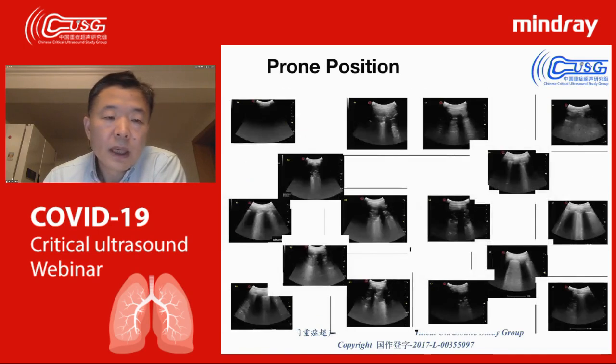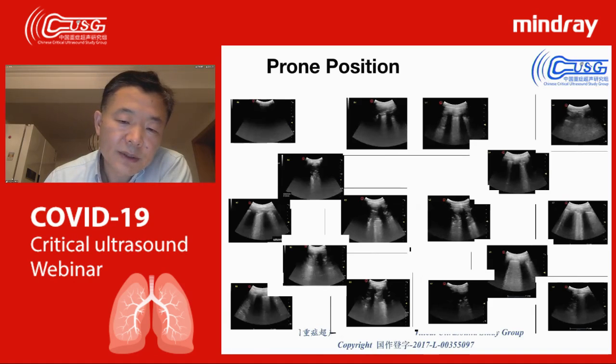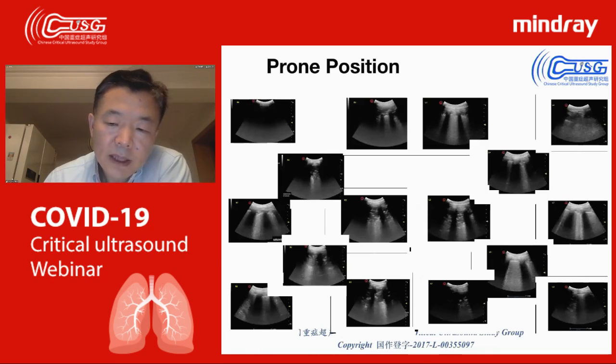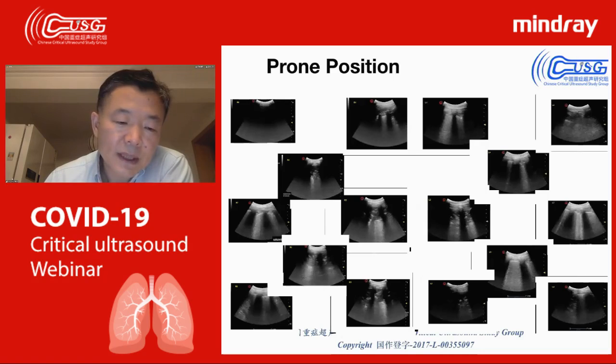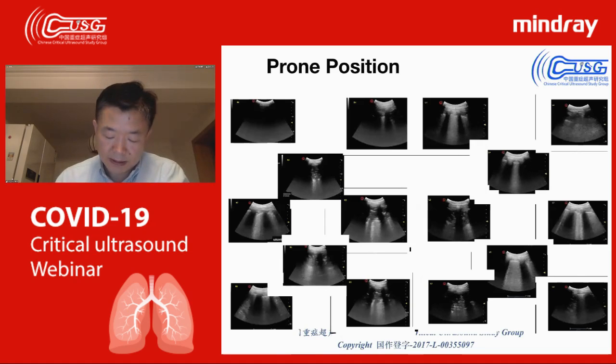So during the prone position, they did this kind of lung examination. You see the lower part, the backside. During this condition, you can check the backside and also the lateral of the chest. You see most of the part is consolidation. And after this prone position, the patient's condition is getting better, changed for the better than before.